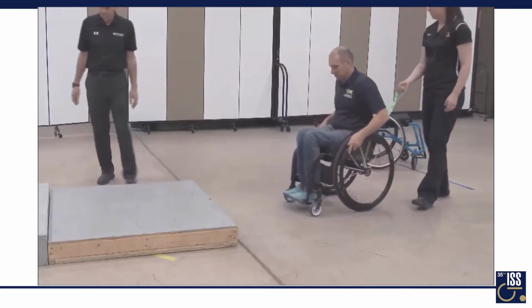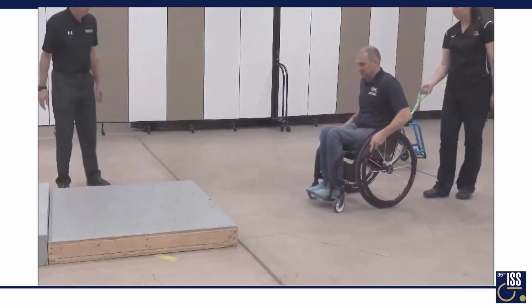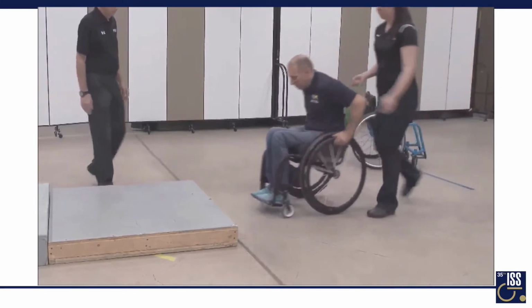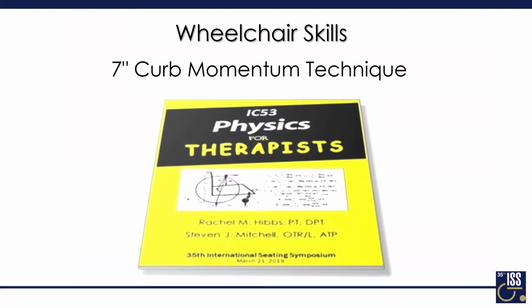If we could get it to pause, you can see that his trunk, his legs, and most of his butt are in front of the axle. That's the key to getting up. Done. So we can move on. I guess Spacebar is not the one to do it.